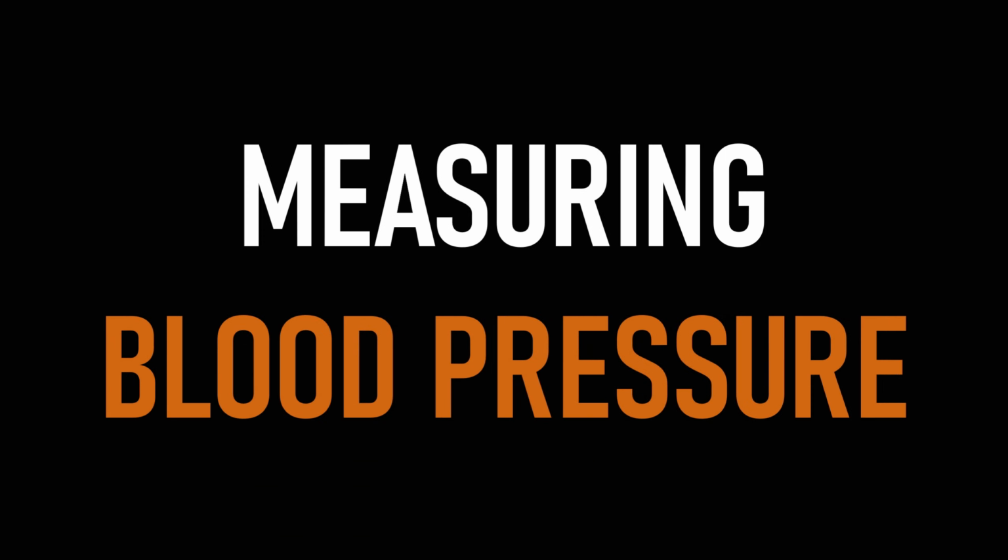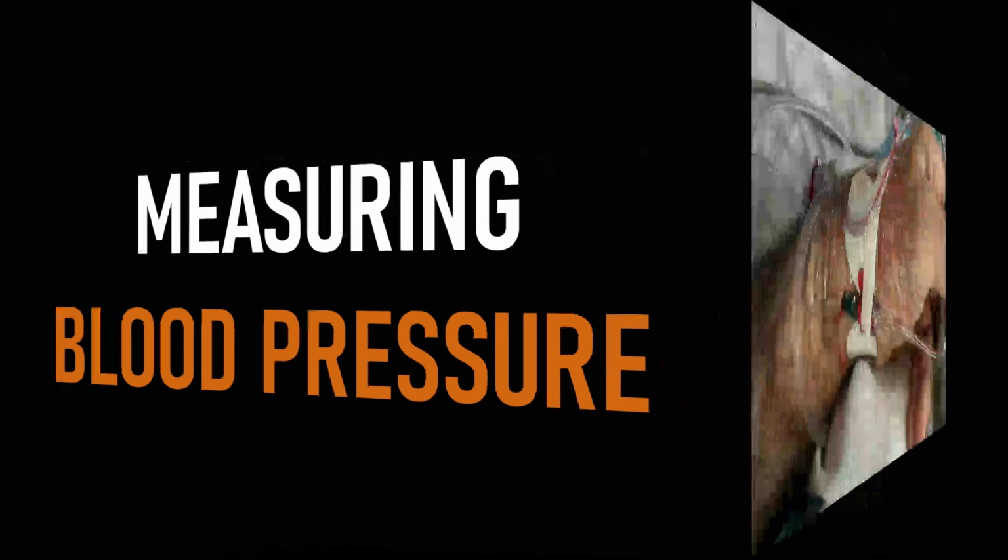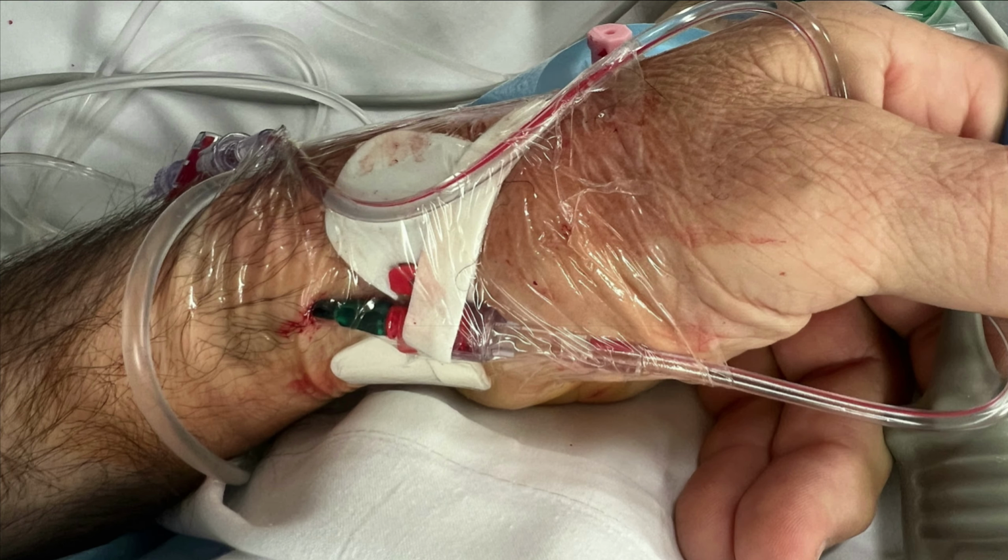Let's move on and talk about the measurement of blood pressure. Anesthesiologists and intensive care specialists love arterial lines. When we are medical students or junior doctors or nursing students, we learned how to measure blood pressure using a stethoscope and using a cuff with, for example, a mercury manometer. But these days, that is rarely done in hospitals.